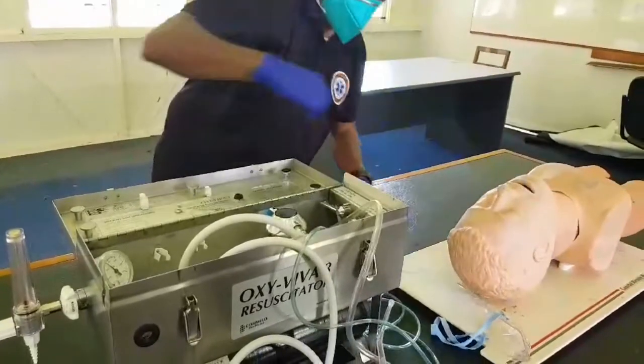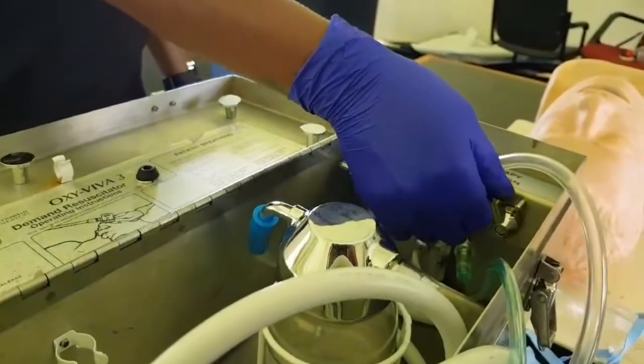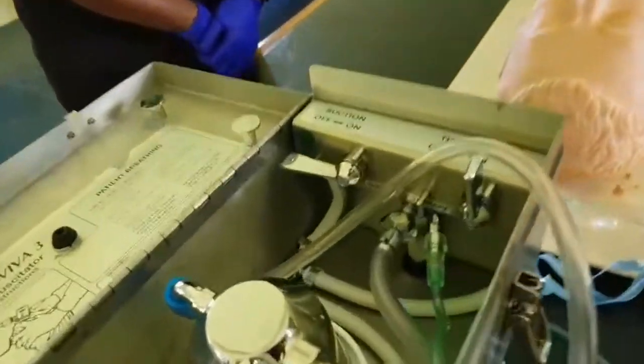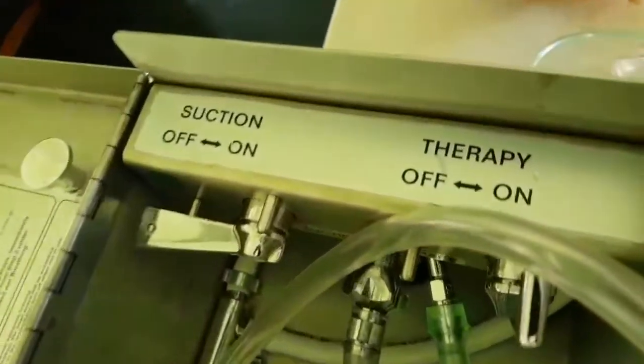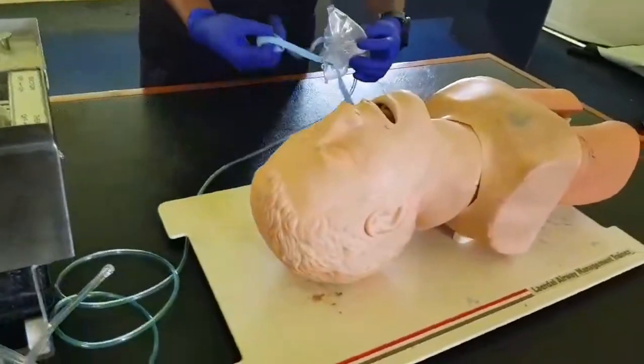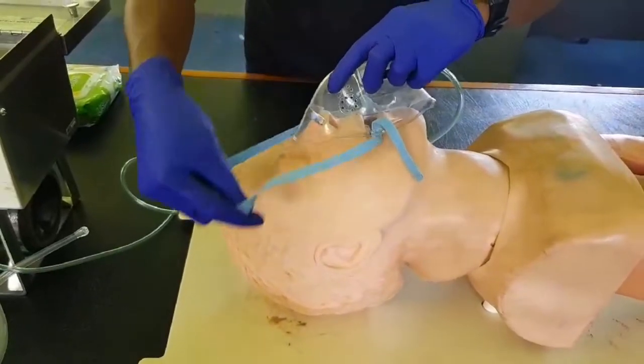Step number three: turn therapy control to on. Step number four: tip the therapy mask to the patient's face and form an effective seal. The elastic bands should pass just above and below the ears, and the soft metal strip should be bent over the nose to form a seal.